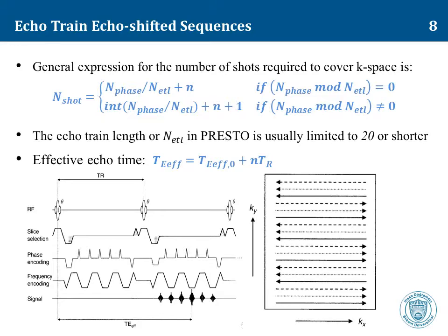The amplitude of the prephasing lobe is incremented each TR interval. A series of positive blip phase encodings are then applied in between the readouts for K-space traversal in the Ky direction. At the end of the echo train, a negative rewinding lobe is applied so that the net area on the phase encoding waveform is 0 in any TR interval.